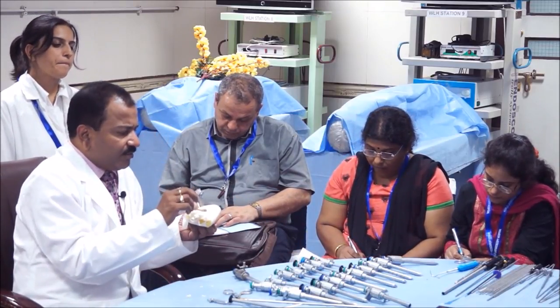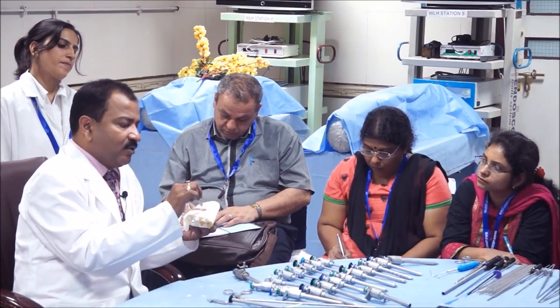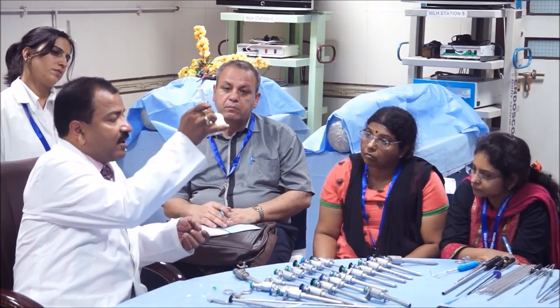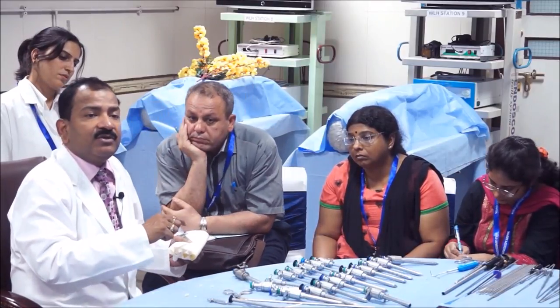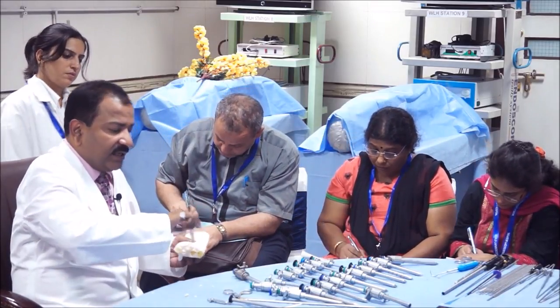If sometimes you are confused whether the drop is positive or negative, then you can do the plunger test. In the plunger test, the piston is taken out here, and then you will see this column will be sucked in. Can you see it is dropping slowly? And this column of water is sucked in. If it is negative pressure, it is sucked very fast. If you are in the preperitoneal space, it will not be sucked, it will stay here only, because a positive pressure is formed due to the fluid there, and then it will stop going further. It is empty now. And these tests are used for the plunger test.